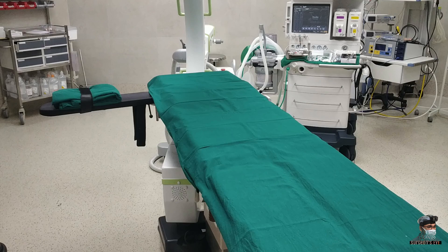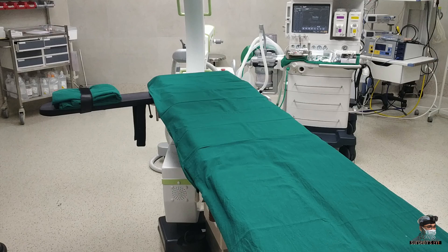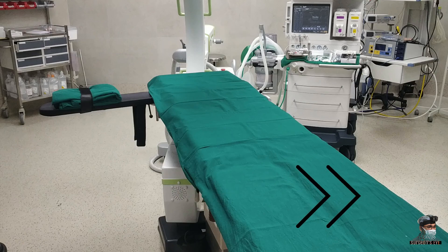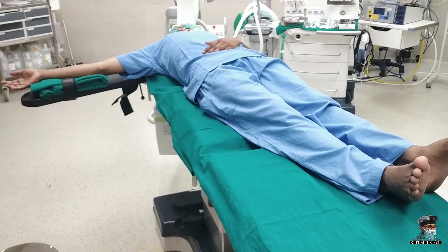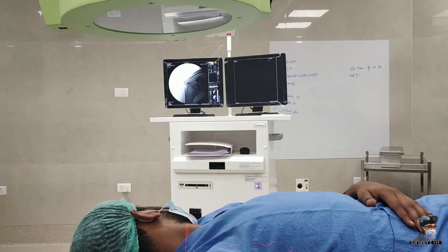The next important thing is to keep the OR table slightly oblique, in a way that the head end of the table should be towards the side of the surgery while the foot end lies a little bit oblique. Similarly, the patient should also lie obliquely on the OR table, such that the shoulder on which surgery is to be performed is more toward the surgeon's side, while the foot end of the patient lies opposite to it.